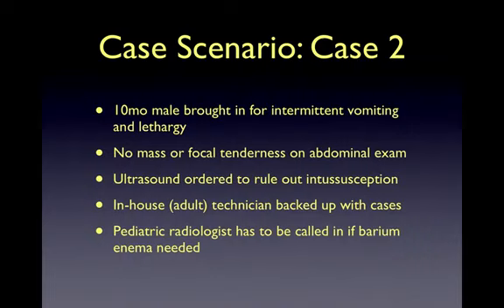There is an adult ultrasound technician in-house, but she is backed up with cases from the rest of the emergency department. The pediatric radiology attending has to be called in from home if intussusception is found and a barium enema is needed. In this case, performance of a bedside ultrasound for intussusception would help facilitate the disposition of the patient.